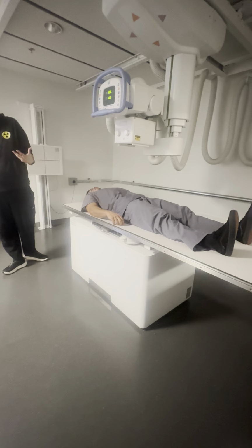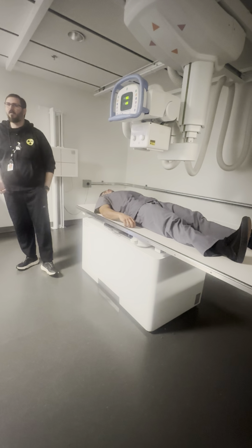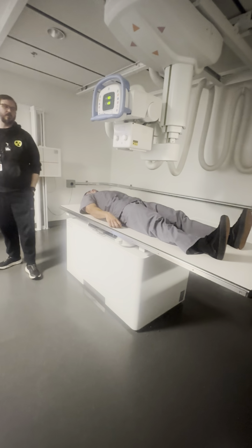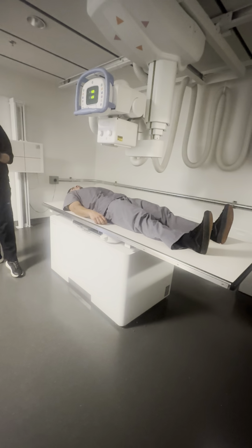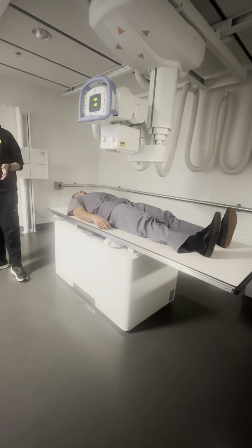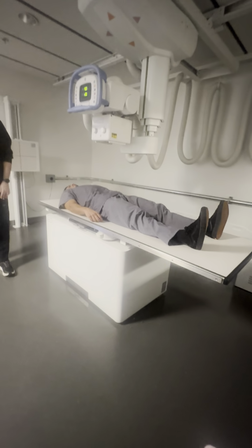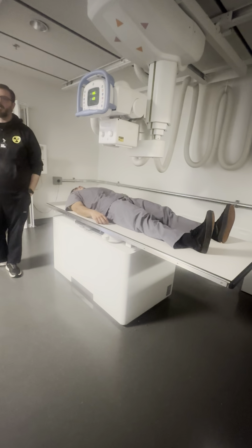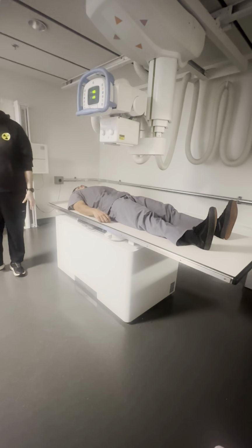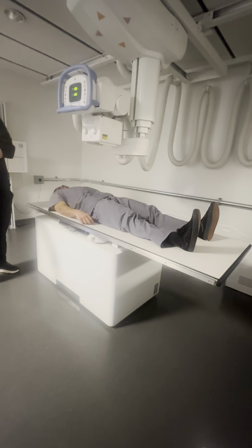I know. But you need to keep an eye on it, especially if you're going to do IV contrast. You better be in the room when you're doing IV contrast, otherwise we have massive issues. That's a patient safety violation right away. With this stuff, your GI system takes time, it's not as sensitive to allergies. You're probably not going to kill someone with the contrast when it's PO. You're going to kill them because you're going to drop them. We're going to talk about that in a second. But the reality is, I still want to see it. I want to watch them and go, you're breathing, you're okay? I want to see that visually before I let them go upstairs or do whatever.